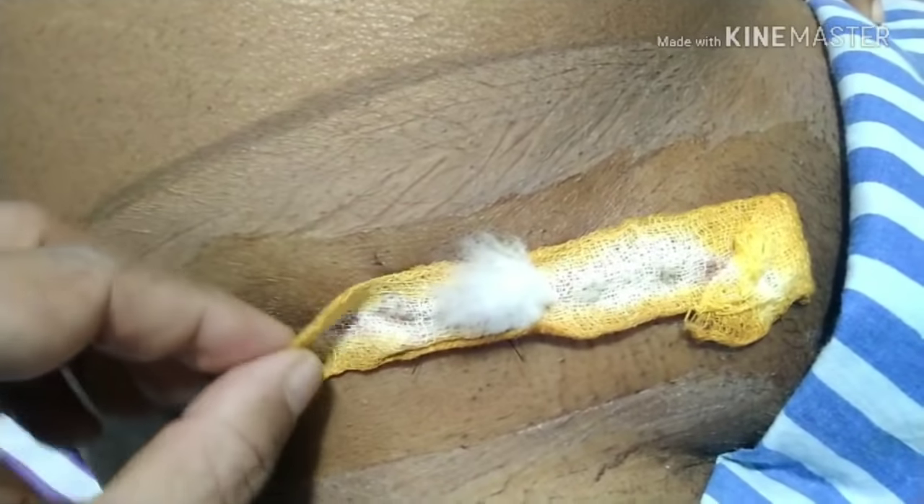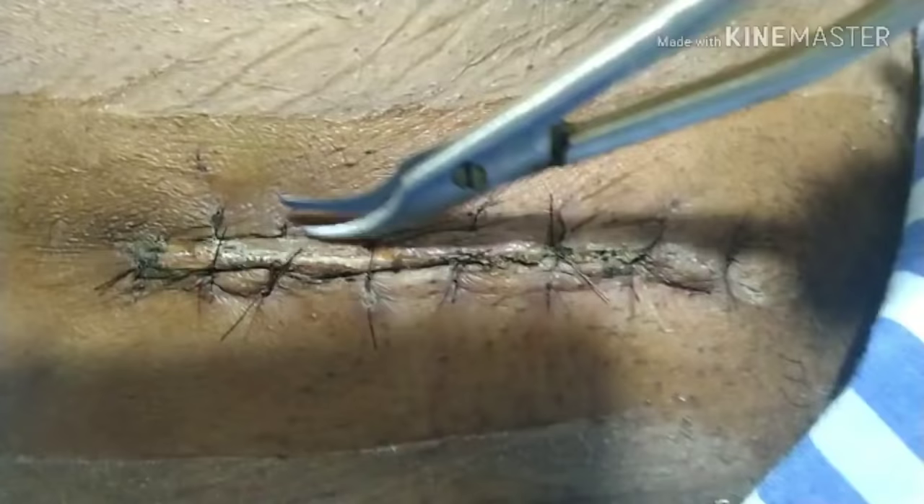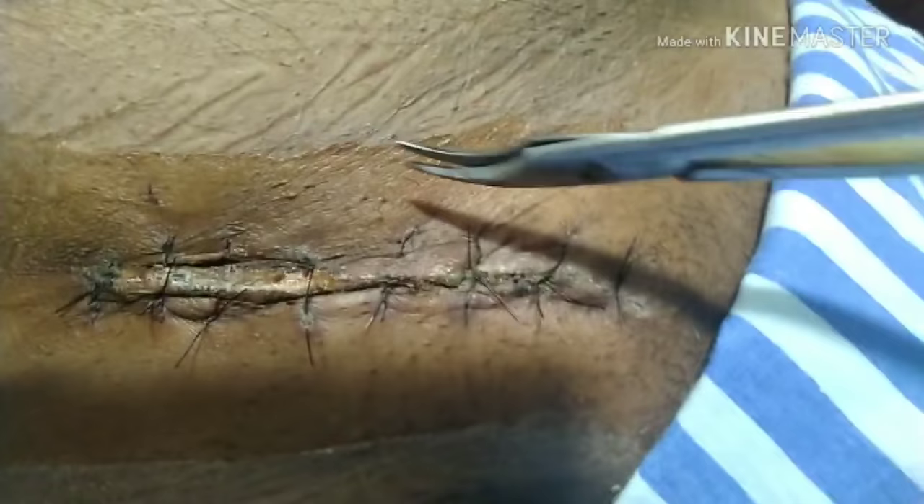In today's video we will learn how to remove a surgical stitch. We need a stitch cutter to remove the stitch. With the stitch cutter, you just cut the stitch — don't cut the knot side, you cut beyond the knot side. This makes it easier and more efficient to remove the stitch.